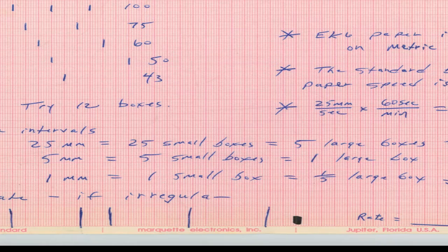Those are the blue up and down lines indicating heartbeats, or again R waves. And so if you have 6 beats in the 6-second period, then you would multiply that by 10, because 6 seconds times 10 would give you a minute.